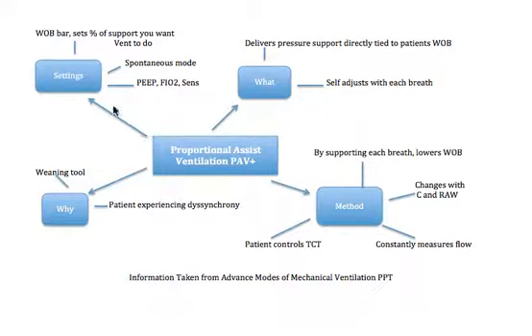So let's go over here to the settings. So the settings that you're going to have with this, right? You've got your work of breathing bar. That's where you're going to get the percentage of the support that you want the ventilator to do. It's a spontaneous mode, so the only other thing that you'll have to set is the PEEP, the FiO2, and the sensitivity.